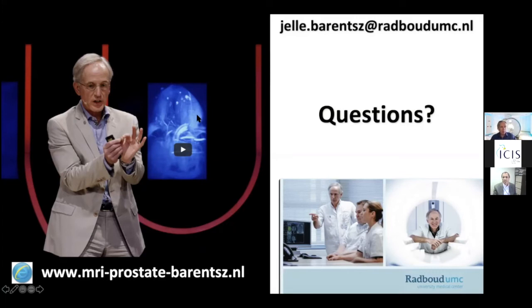The other thing is that if you use contrast, an early enhancement of a focal area to upgrade a 3 to a 4, then there is rationale, but it's not 100%. You're not absolutely sure that based on just simple early enhancement, the tumor is definitely an aggressive cancer. So you need to be careful, but it gives an indication.